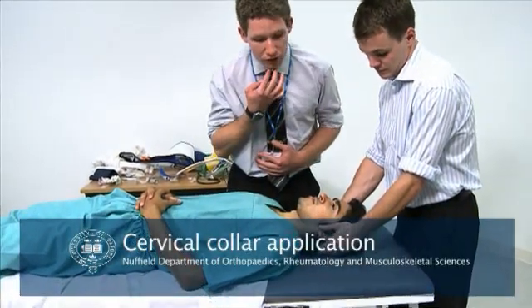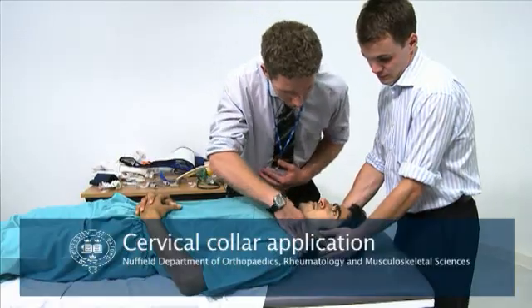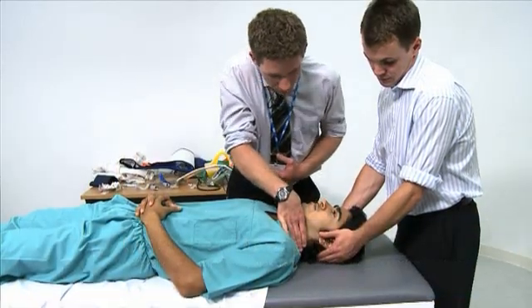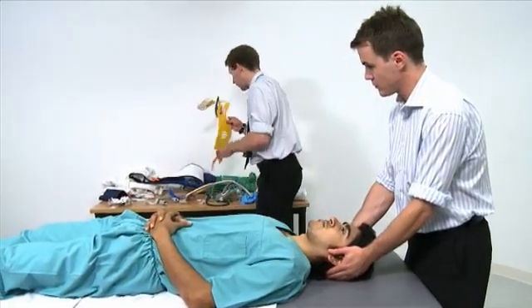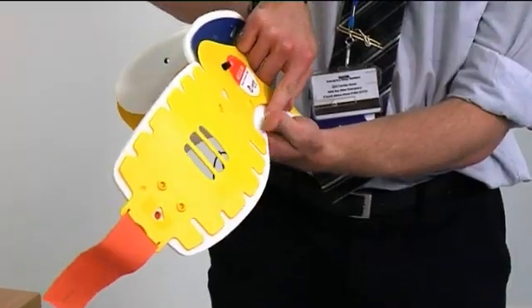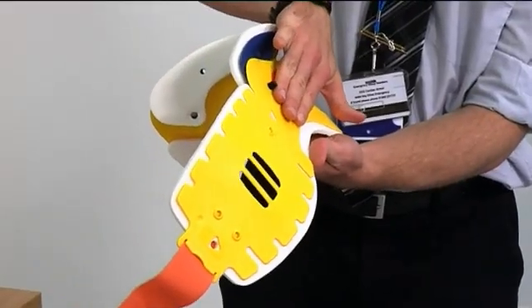You measure from the chin to the trapezius muscle at the back — not from the angle of the jaw to the trapezius. On this patient, that is three fingers. You then measure on a collar from the black stud to the bottom of the yellow plastic, rather than the white foam. Three fingers is the right size for this patient.